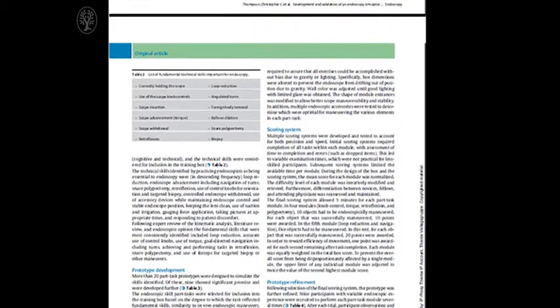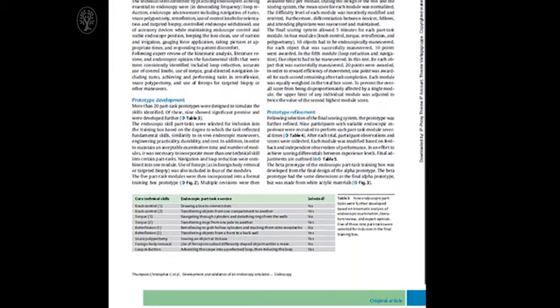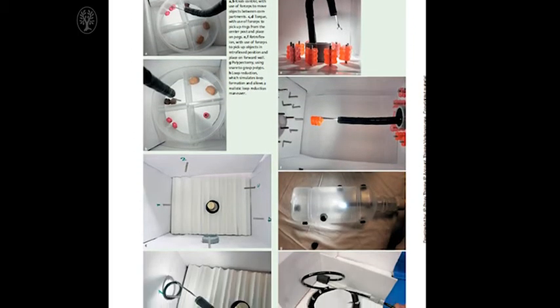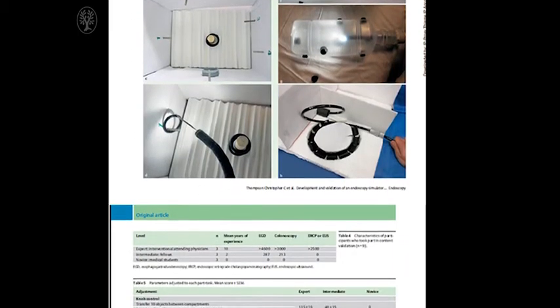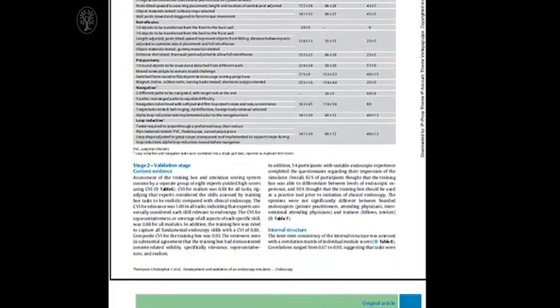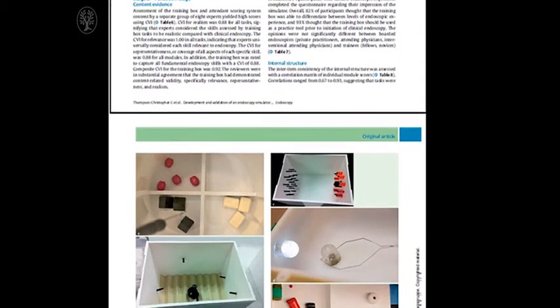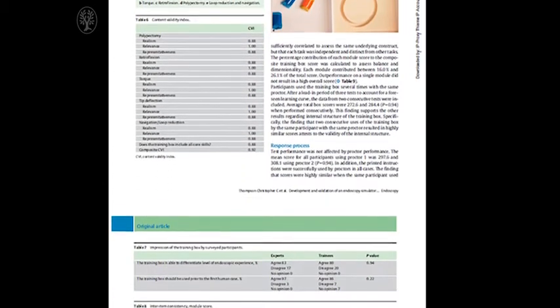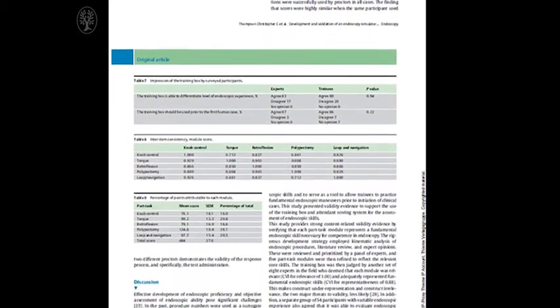We also did literature review and relied on an expert panel to help come up with our final list of fundamental endoscopic skills that the simulator was then built around. Several simulator prototypes were rapidly developed and modified numerous times. These simulators were built in conjunction with a scoring system, which was then validated.